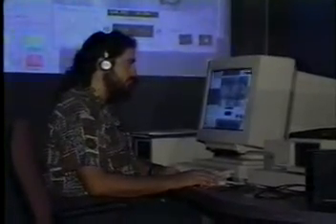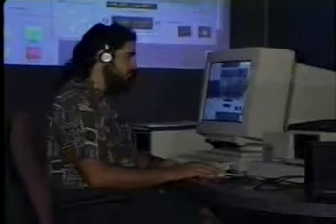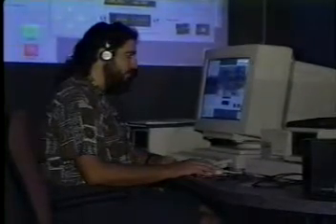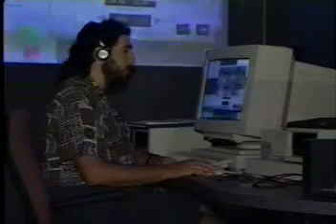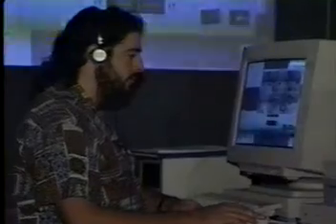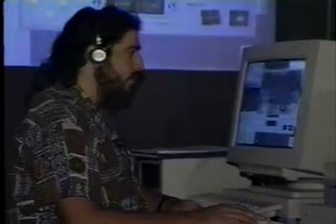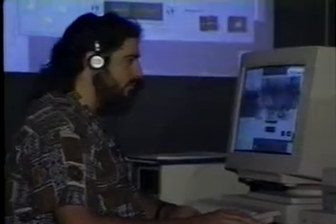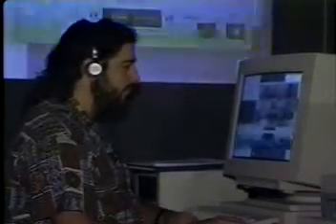Thank you. San Diego, are you ready? I'm sorry, San Diego. Your specimen is up, and we're showing you a low magnification image right now. Okay, could you link that to me, please? Okay.